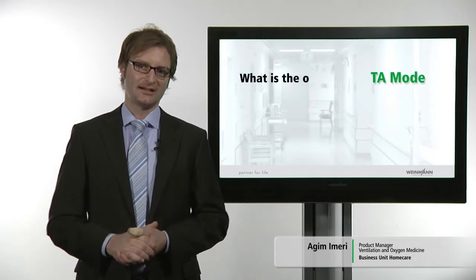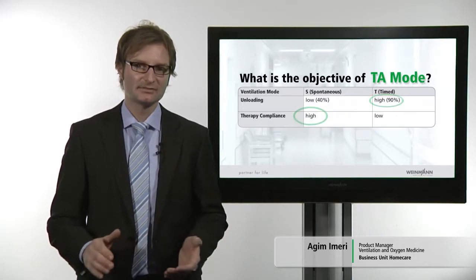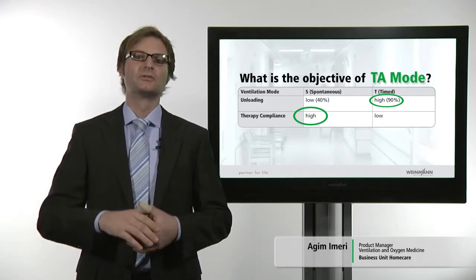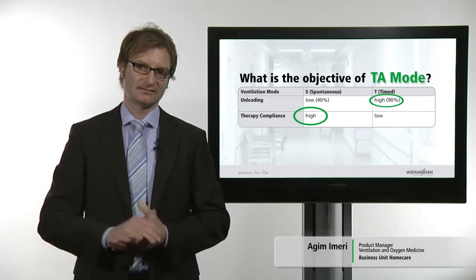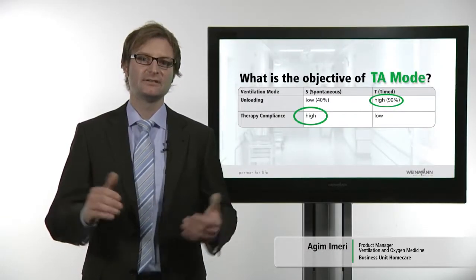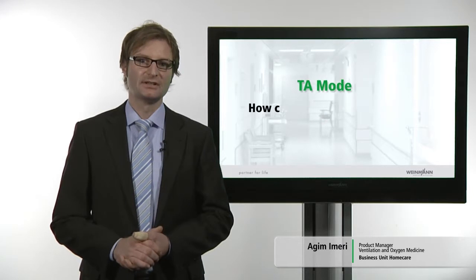What is the objective of TA mode? The objective of TA mode is combining high unloading of the respiratory pump with high therapy compliance. How can this objective be achieved?